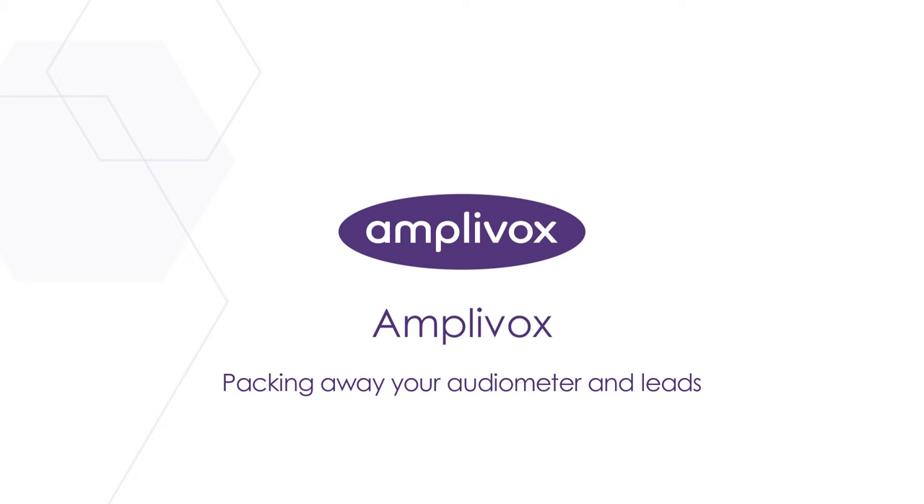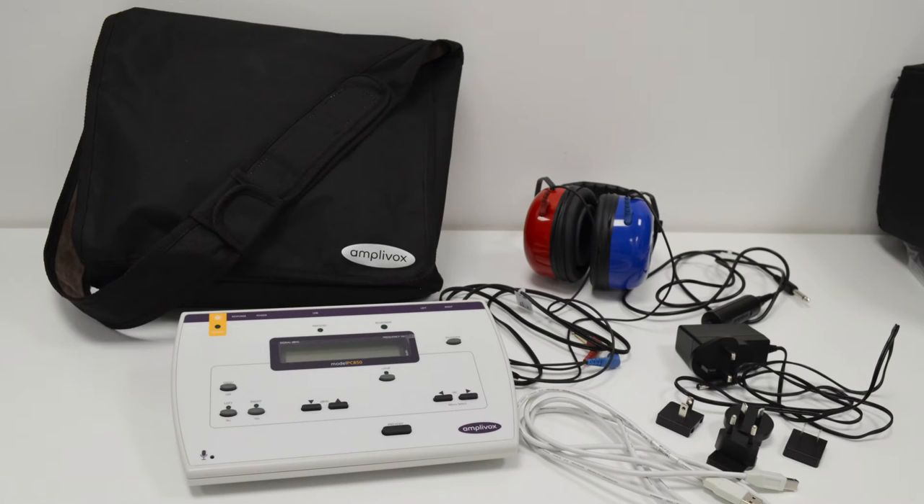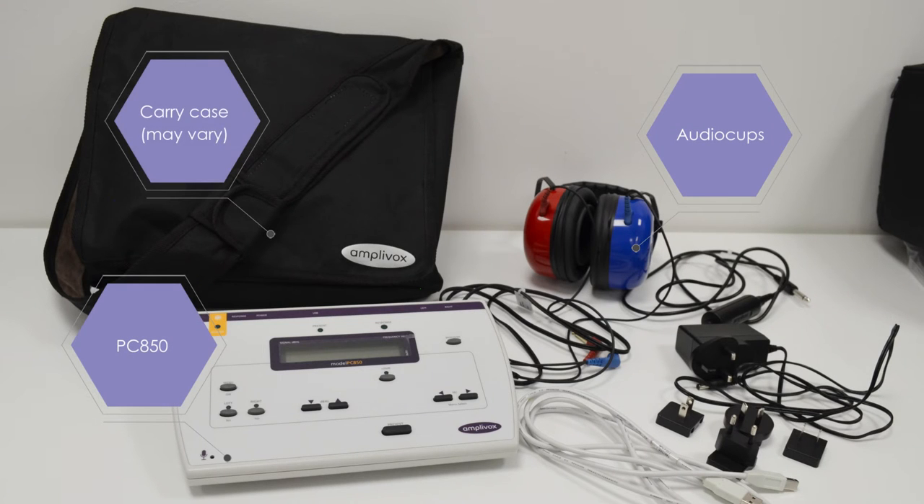Hello and welcome to this short video which will demonstrate how to best pack your audiometer and leads to prevent damage. In this video we use the PC850 audiometer and audio cups. The advice provided generally applies to all audiometers, headphones and leads.